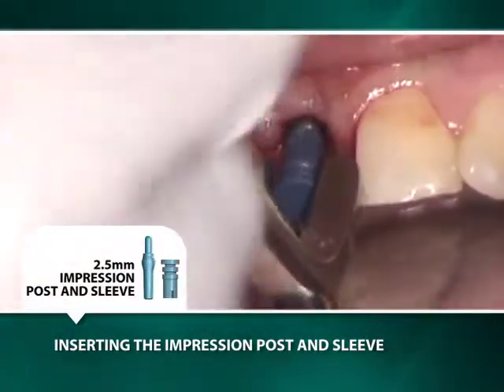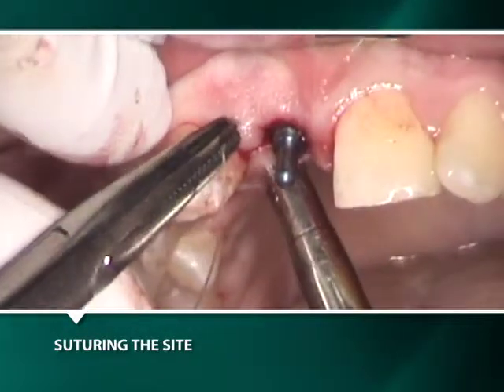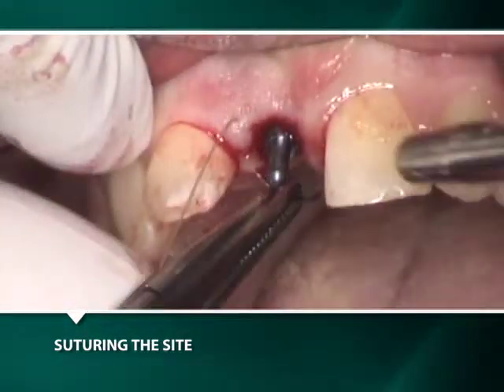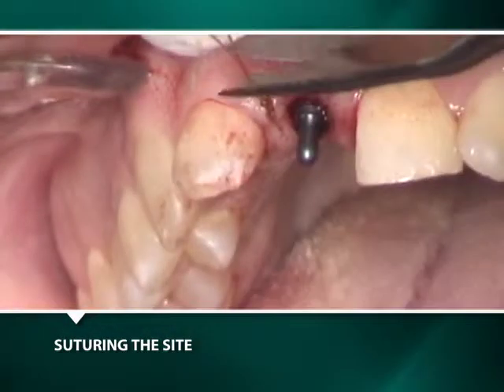A blue 2.5mm impression post with a blue plastic sleeve attached is inserted into the well of the implant for the making of an implant-level transfer impression after the placement of a single interproximal suture.